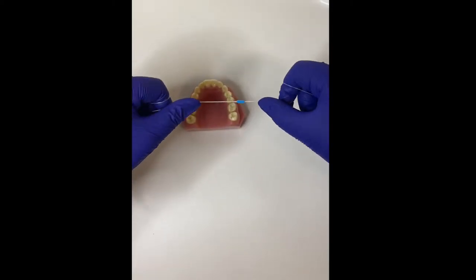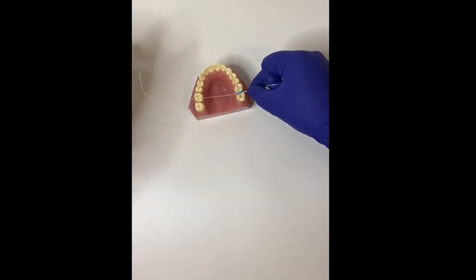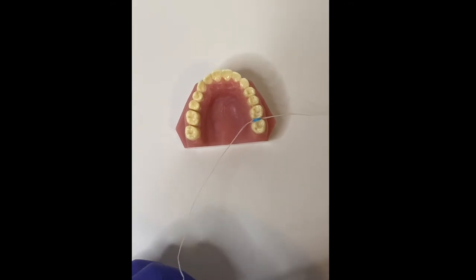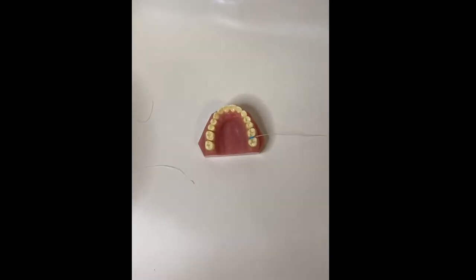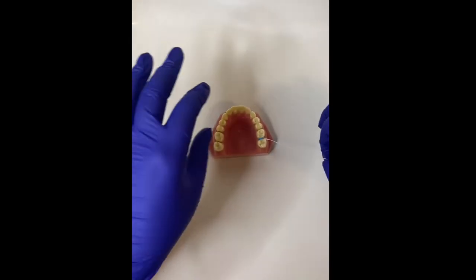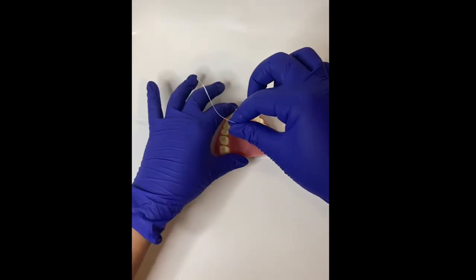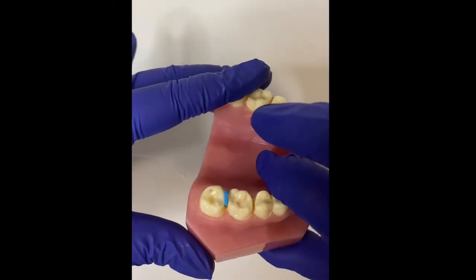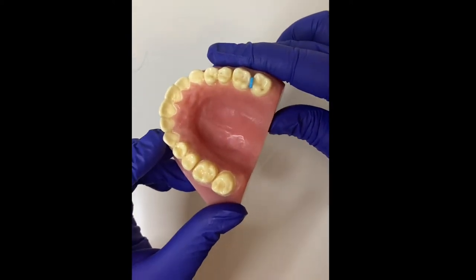At your very first visit, we're going to be adding the separators. Separators are little rubber bands that we put in between the teeth. Typically, we floss it through the teeth and then allow half of it to be inside of the contacts and half of it to be out. You might at times have to wiggle towards the tongue side to allow that half and half to happen. Once the separators are in, we will remove the floss and repeat the process. You might have two to four separators depending on how many adult teeth you have.